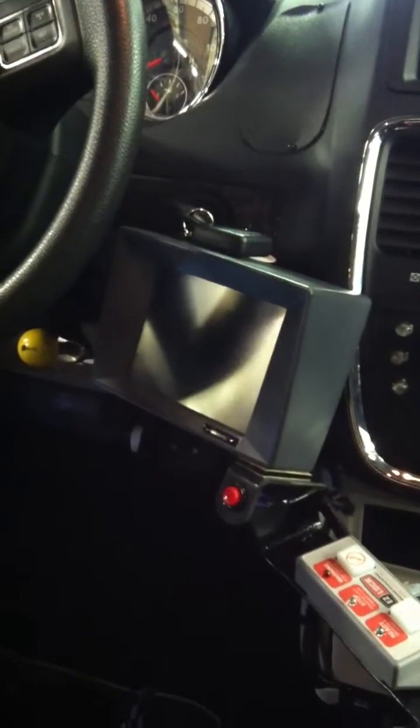Hello, I'm Pat from Mobility Supercenter and this is a new install that I've done. It's an AVIT with WL, which means a wheel and lever system. Let me show you how it works.